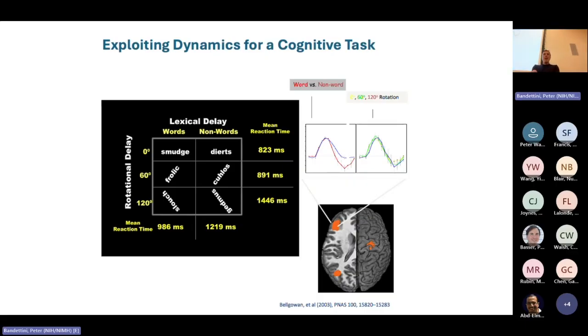So when people say, oh, because the hemodynamic response is slow, we can't resolve things, no, that's not the right way to say it. It's because the hemodynamic response varies over space that you can't resolve things absolutely. And it's because it's noisy that you can't resolve lower than 100 milliseconds in the onset timing if you modulate the stimulus. But this can be applied really nicely to cognitive tasks.